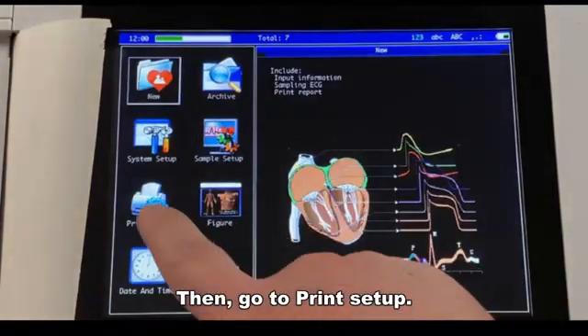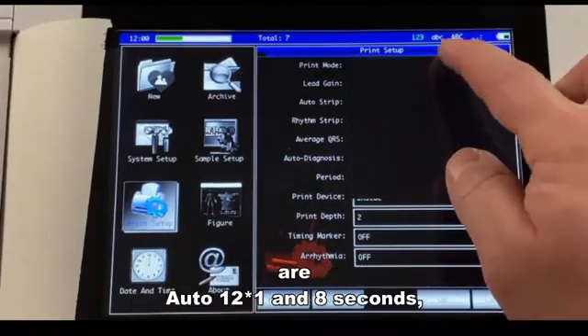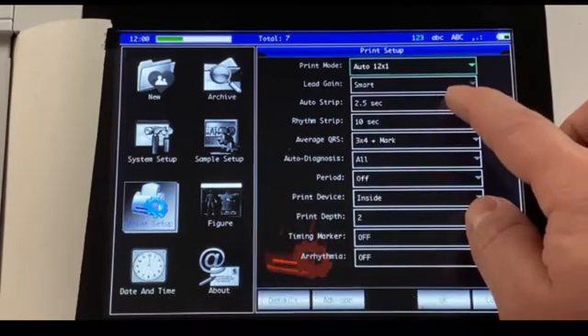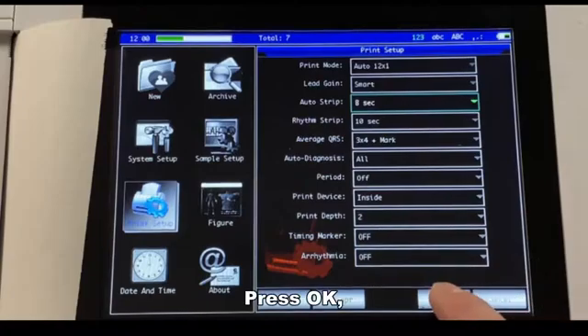Then go to Print Setup. Our suggestion for the print mode and the auto strip are Auto 12×1 and 8 seconds. Press OK.